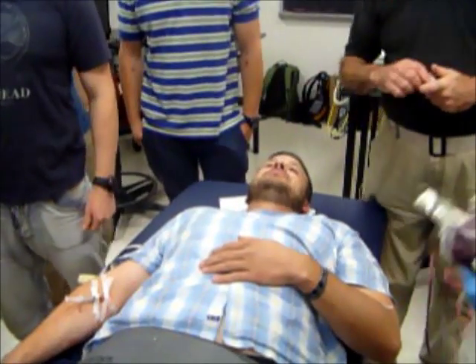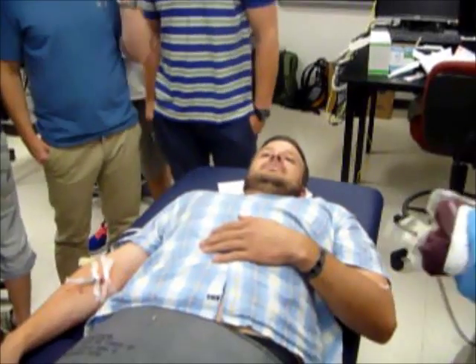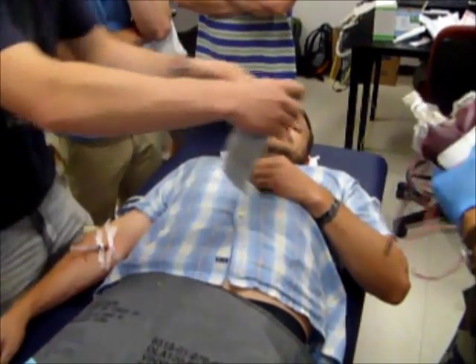Okay, one nitroglycerin. Perfect. So 30 seconds and then start his tilt. And when you stand him up, if he starts to fade out, try to pump up the pants with him standing.